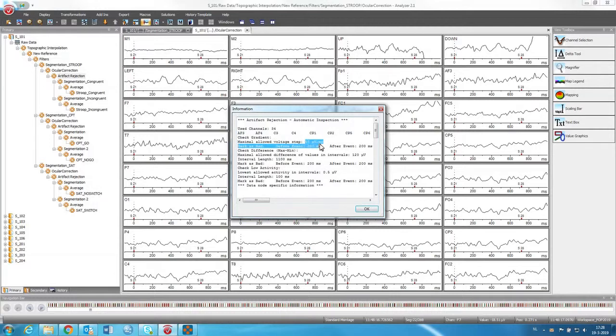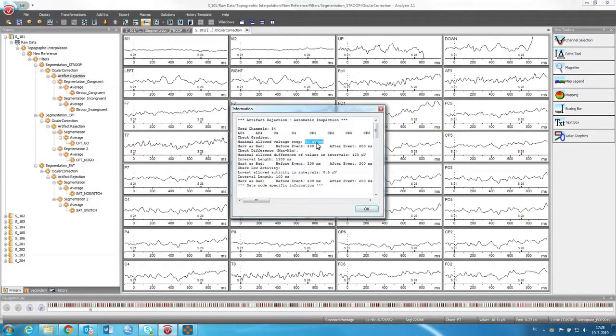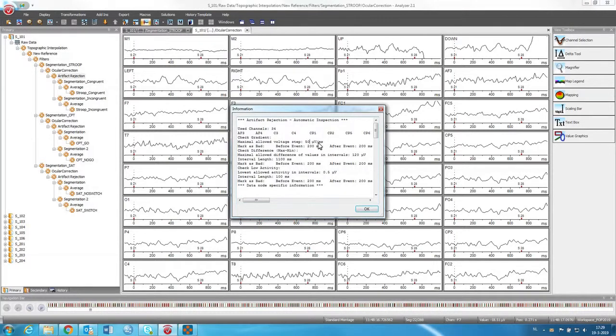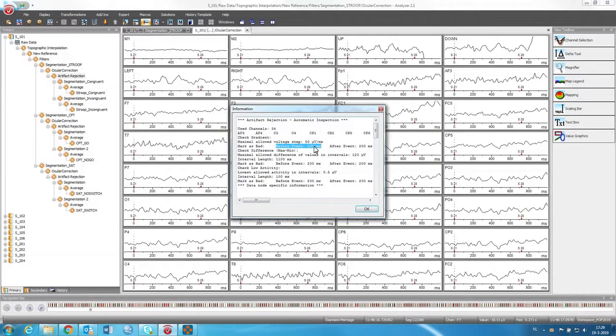So let's look at this operation infos. So it says that it's doing this on all these 34 electrodes. And what it's saying is that we want only a maximum allowed voltage step of 50 microvolt per milliseconds. So if there's any big step of increases or decreases of the voltage per millisecond, that will be removed. And it will be marked as bad before the event and 200 milliseconds after the event.